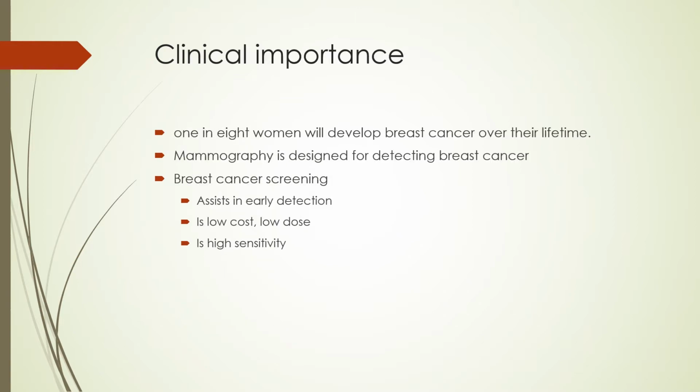Mammography is important because approximately 1 in 8 women will develop breast cancer over their lifetimes. Mammographic exams are designed for detecting breast pathology, particularly breast cancer. Breast cancer screening with mammography helps in detection of cancers at an earlier age. Early detection is important for effective treatment. Breast cancer screening programs depend on X-ray mammography because it is a low-cost, low-radiation dose procedure that is sensitive enough to detect early-stage breast cancer.